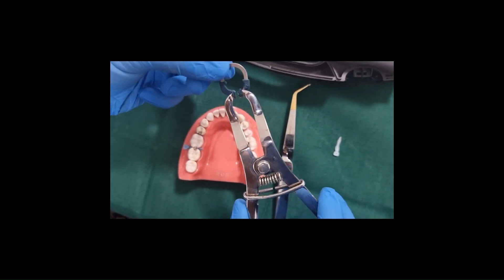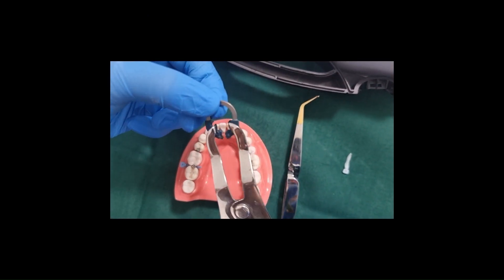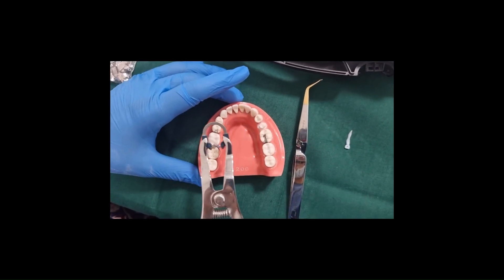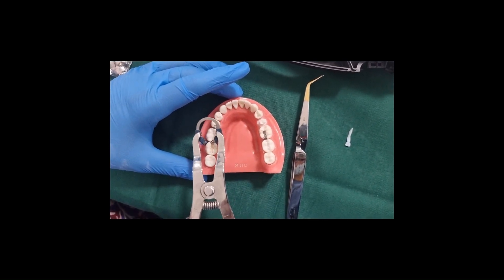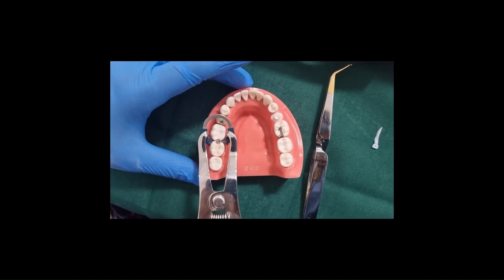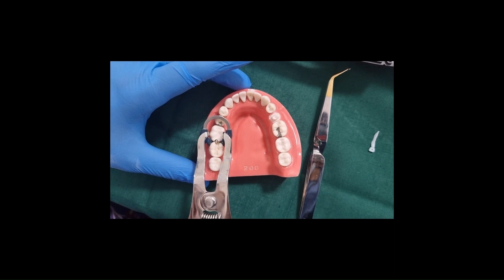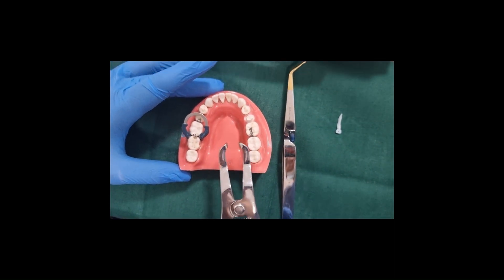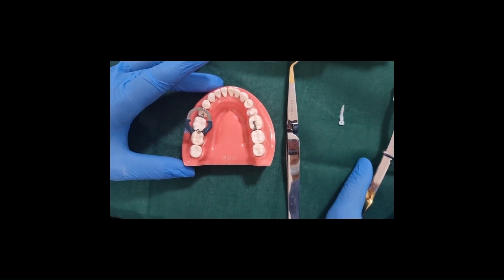Next, load the V3 ring in the forceps and expand the ring slightly, taking care not to over-expand. Make sure the ring is seated well onto the prepared tooth before restoring it with composite.